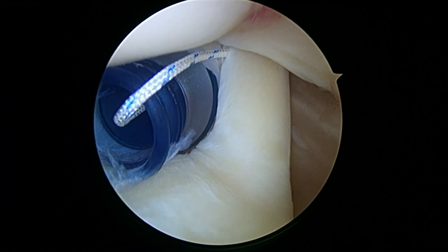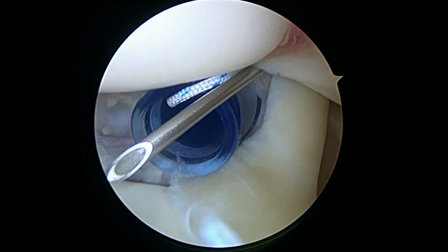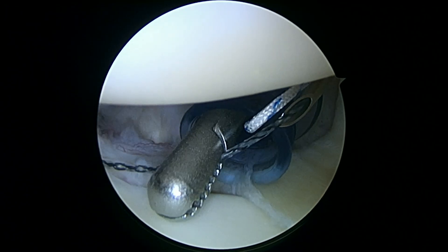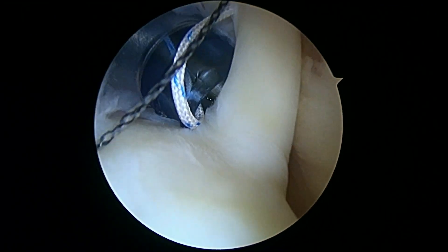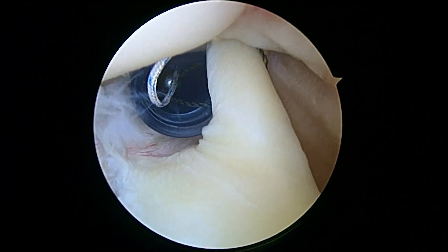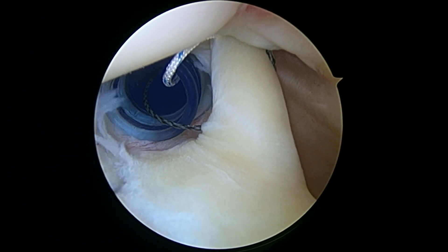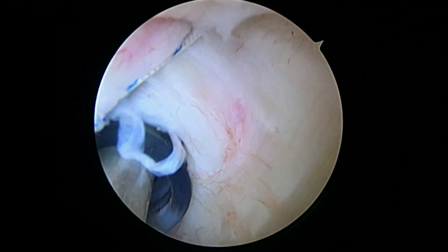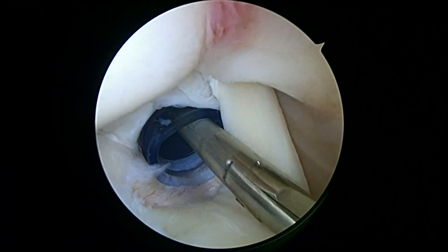Now we're going to do the same thing one more time — we can go right next to it. There's our second pass. We're going to take the same black wire, but I'm not going to bring that wire directly out. I'm actually going to sneak around behind the biceps — see how we go around the biceps. That's going to give us a much stronger stitch. So here you can see we've got that suture going all the way around the tendon — it goes around the back and then out the front. That gives us a loop of suture all the way around the tendon.